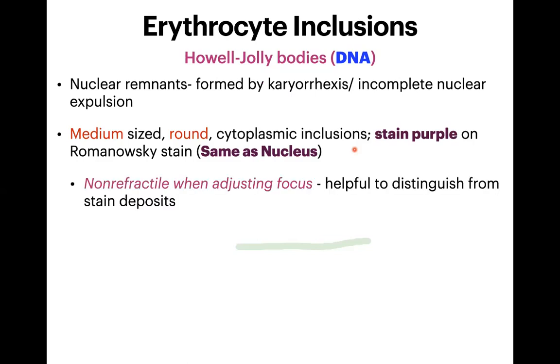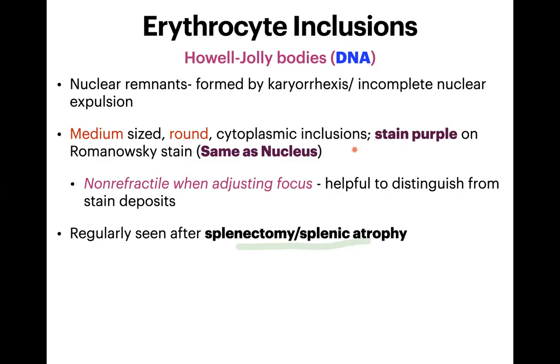They are non-refractile. So how to distinguish from the stain deposits? Just adjust your focus up and down. The stain particles will be refractile, but these Howell-Jolly bodies will not be refractile. They are regularly seen after splenectomy or splenic atrophy.